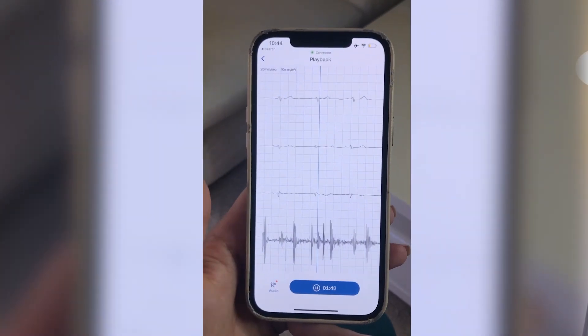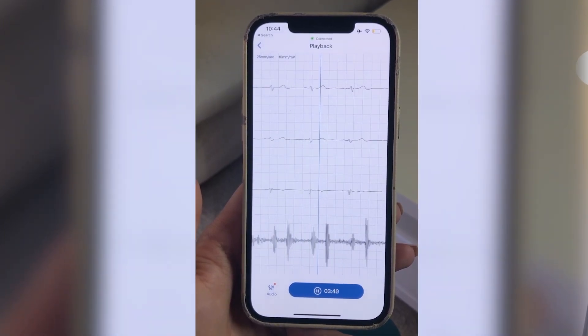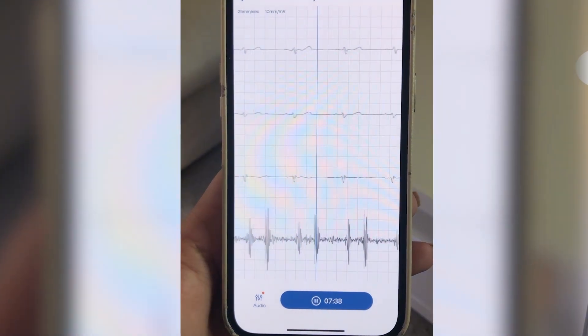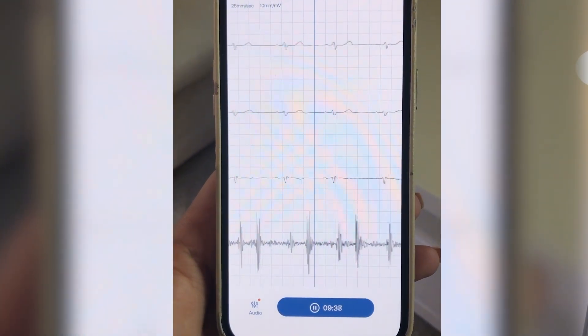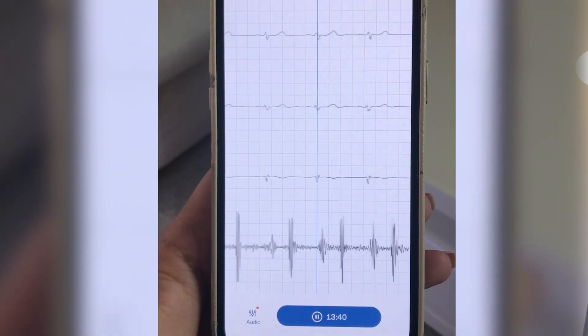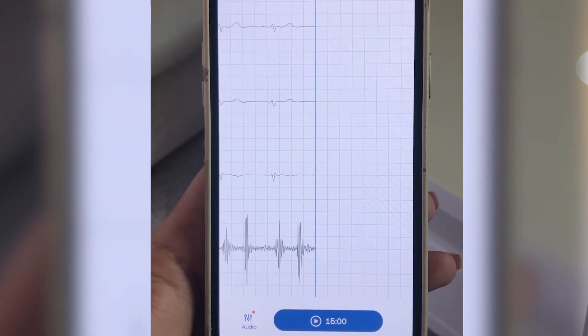What sets the Echocore 500 apart from traditional stethoscopes is its wireless connectivity. You're able to pair it with the Echocore app on your smartphone and you can record, visualize, and even share the heart and lung sounds with your colleagues or patients. It's an excellent tool for educational purposes and telemedicine consultations.